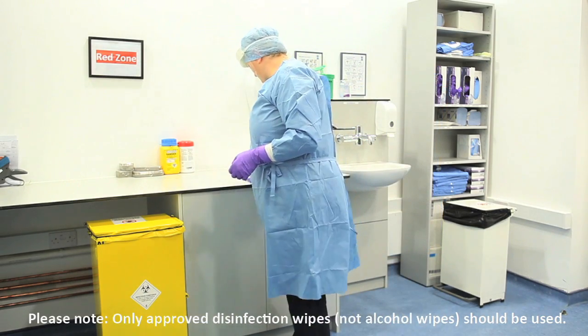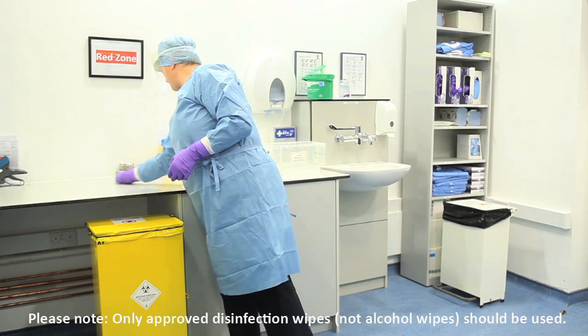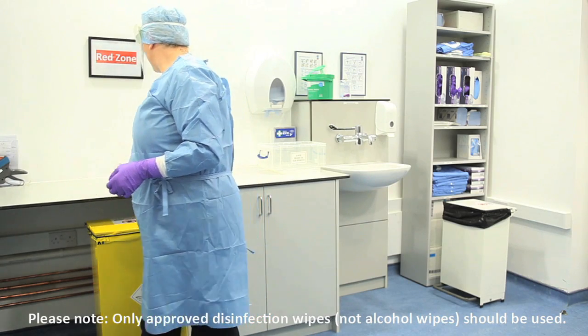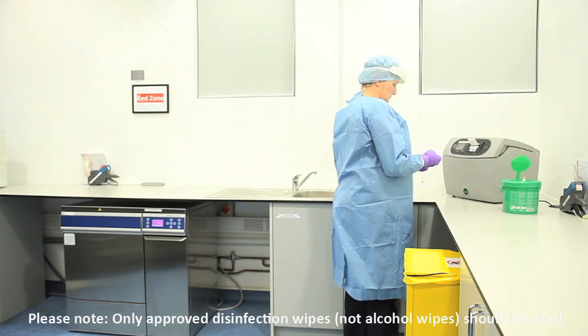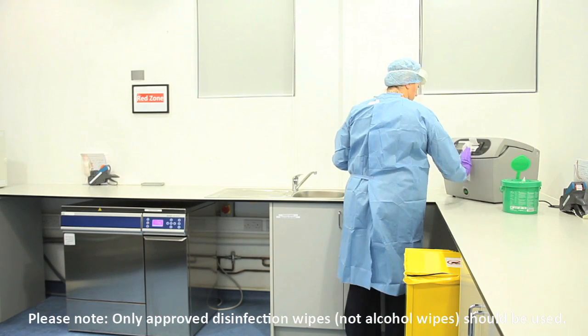Effective wipes will kill bacteria, fungi, viruses and spores. Wipe in one direction only and do not cover the same areas twice. The disinfectant wipe must be changed if it becomes dry or heavily soiled. The surface is allowed to air dry.